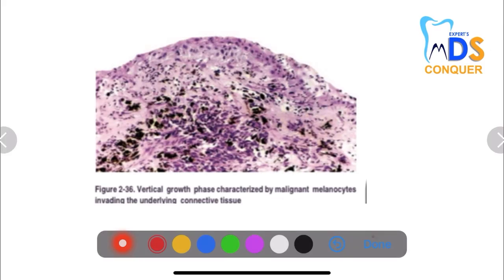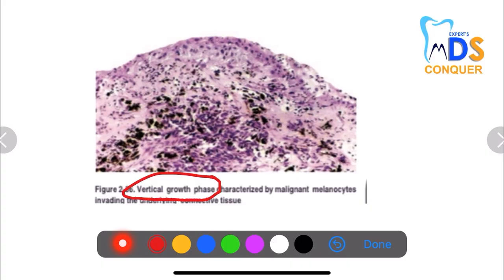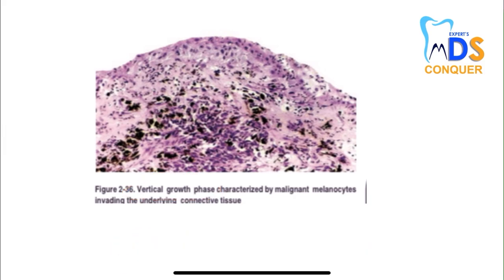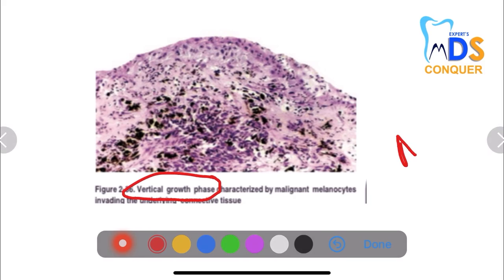Here you can see many malignant melanocytes invading the underlying connective tissue. This is the vertical growth phase, which is characterized by malignant melanocytes invading the underlying connective tissue, seen with malignant melanoma.